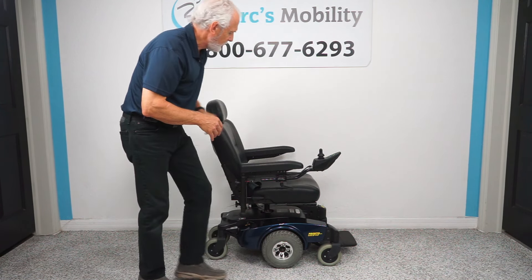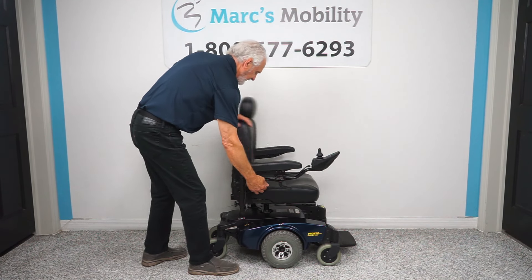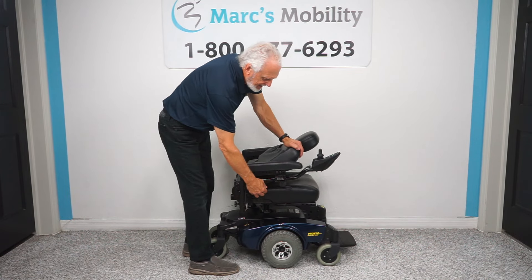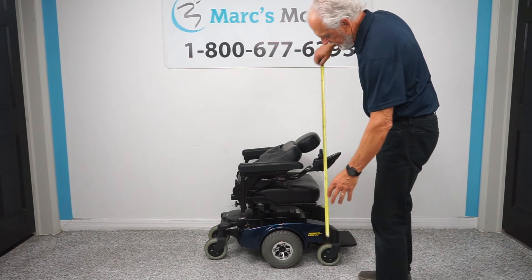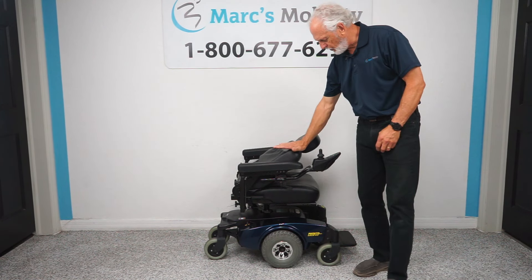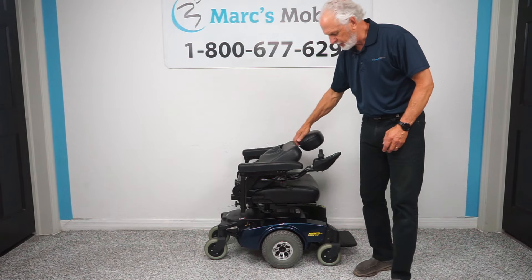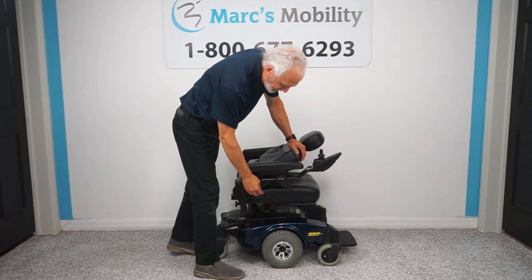Several things. Number one, it has a captain seat, so you can adjust the back and flip the seat down. The high point, if you're going to travel with this chair, would be about 32 inches with the headrest off. So at 32 inches high point, you can ramp it into a minivan or an SUV.